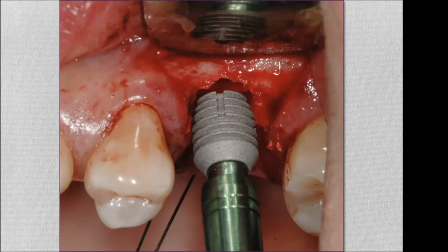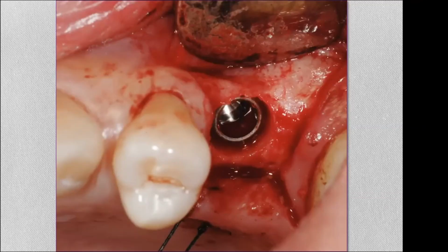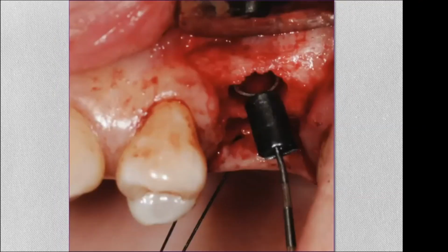Then we take our implant with the inserter retriever. Learn how to use this because in case you make a mistake, you can retrieve the implant. Okay. And with gentle tapping, we seat it to final seating or very close to final seating. We know it's stable, it's secure. It may need another millimeter of seating. More often than not, we're finished with that. Then we disengage the inserter retriever. Okay. Trim our black healing plug.